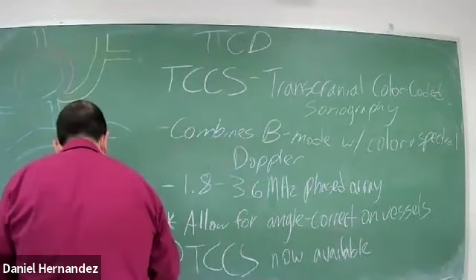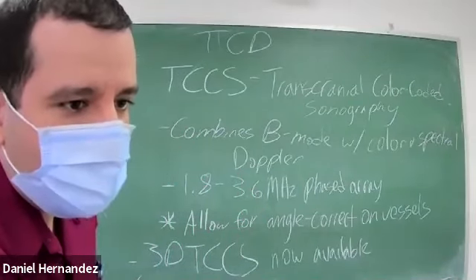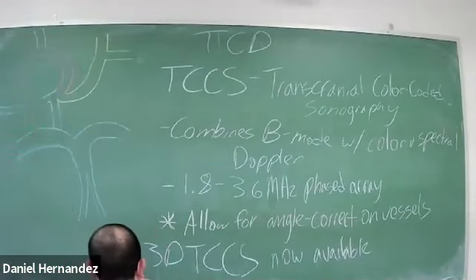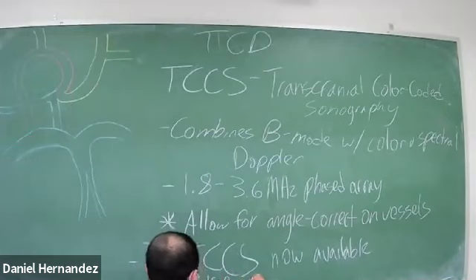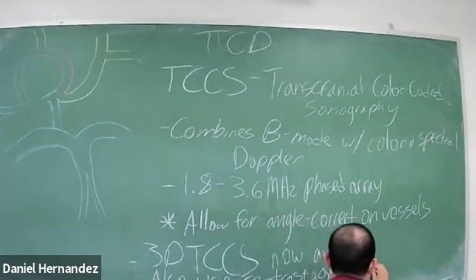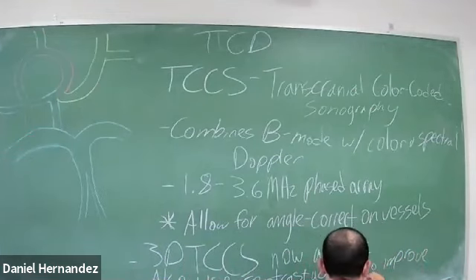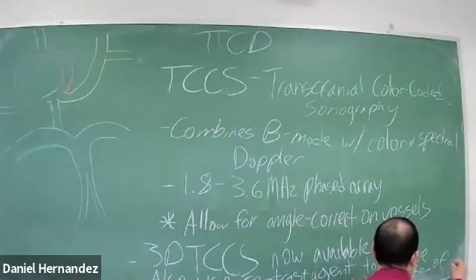And we also administer contrast agent to improve evaluation of intracranial blood flow. So we'll use contrast agent to improve visualization of vessels.